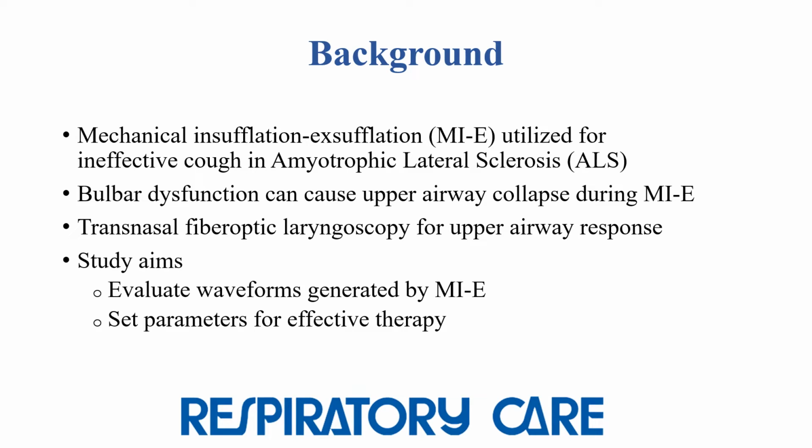The aim of this study was to evaluate waveforms generated during MIE therapy to detect airway obstruction and to modify settings for effective mechanically assisted coughing.